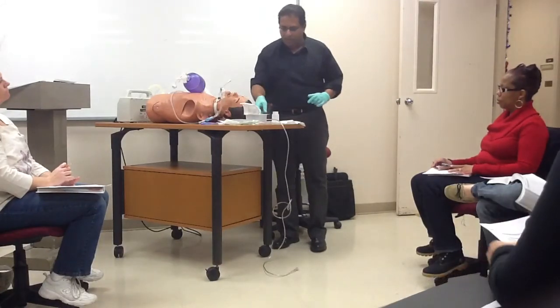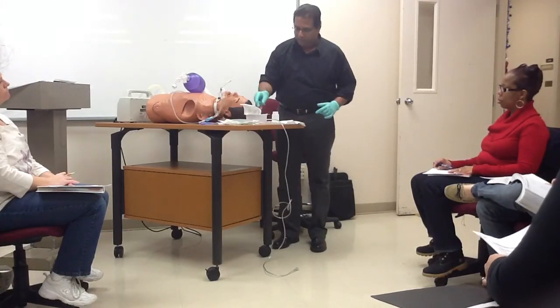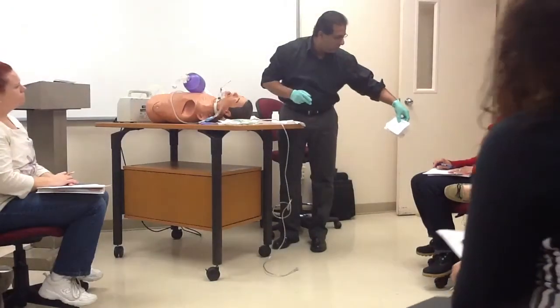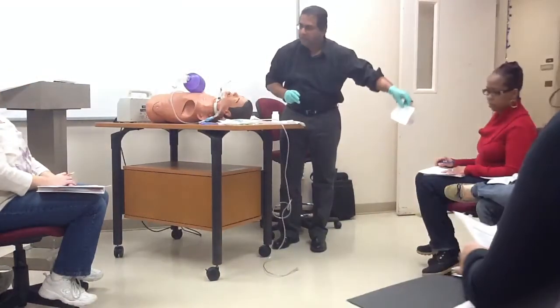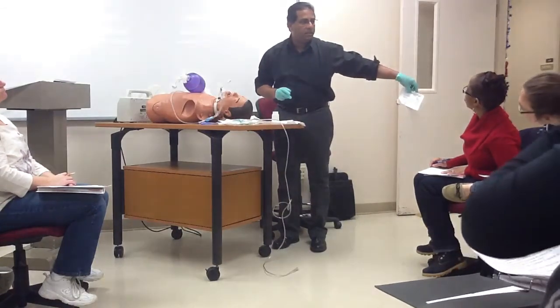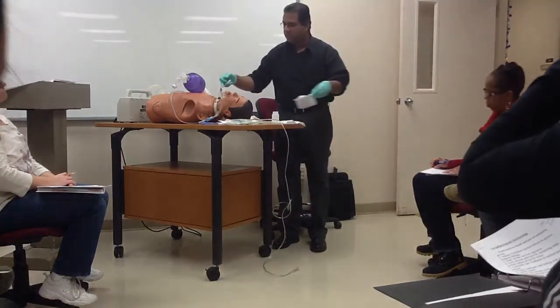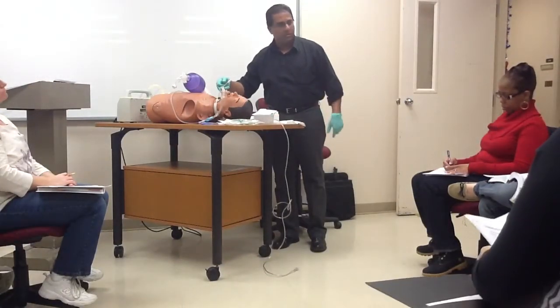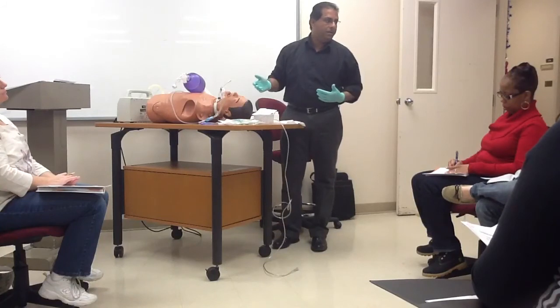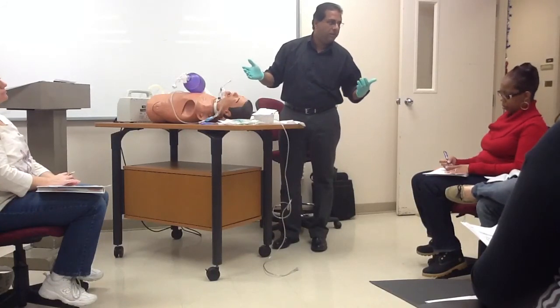This suction catheter obviously is not going to go through here. What suction catheter is this? Does it say? I can see it, 14. Anybody see this? 14 French suction catheter. Can I suction with the 14 French for this particular trach? This is a size 4. No, it's not going to go in, but I'm just going to pretend.